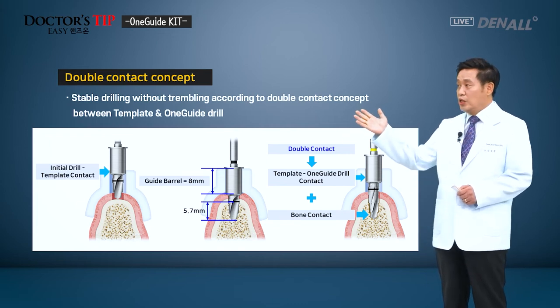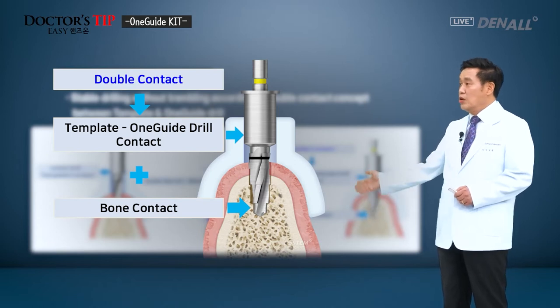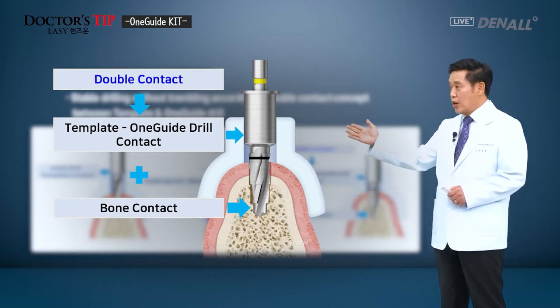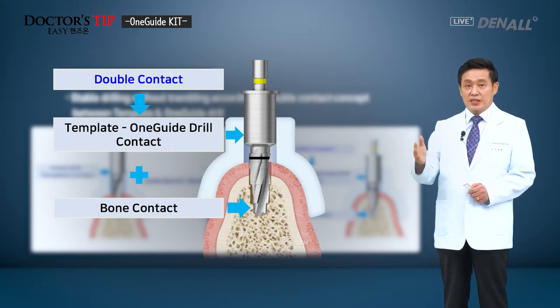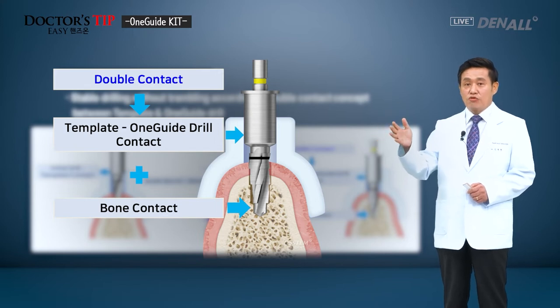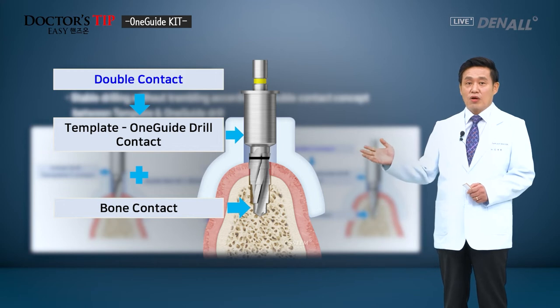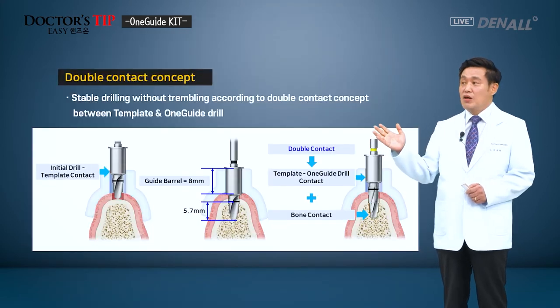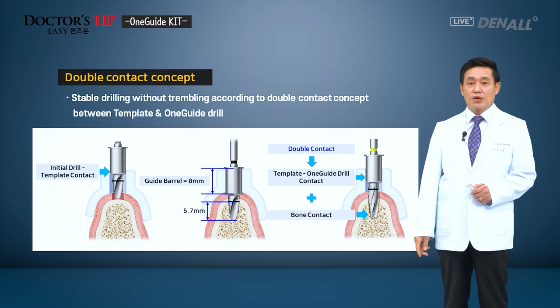And using one guide drill, you'd contact the bone on the bottom, and on the top you'd have contact with a template, so you'd be able to drill stably and there will be no shaking. You'd be able to place the implant in the desired area. When you use the short initial drill, you'll be able to drill firmly and stably in the desired position.